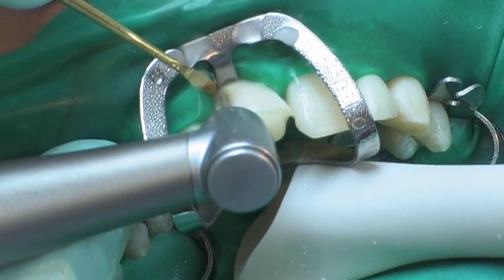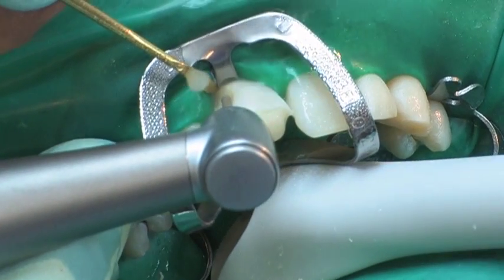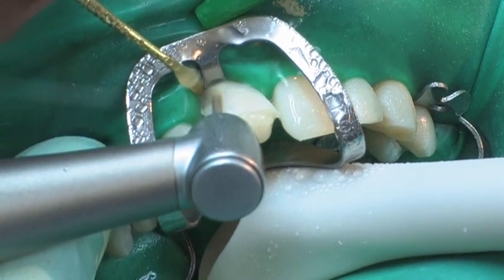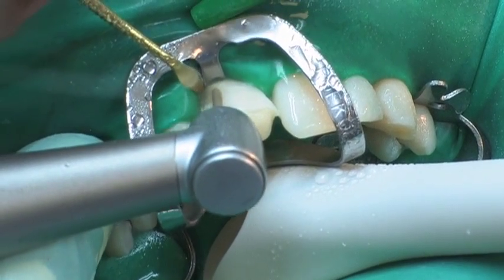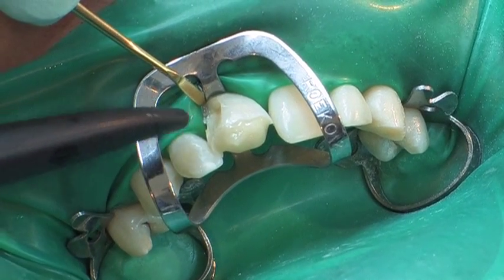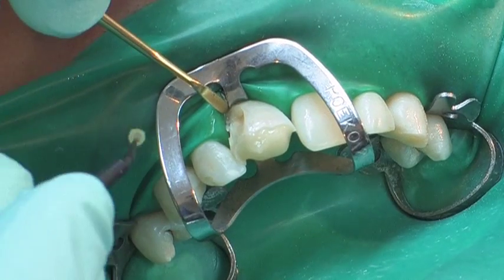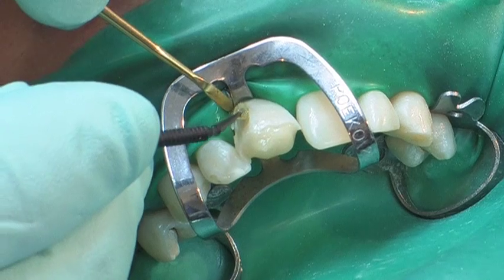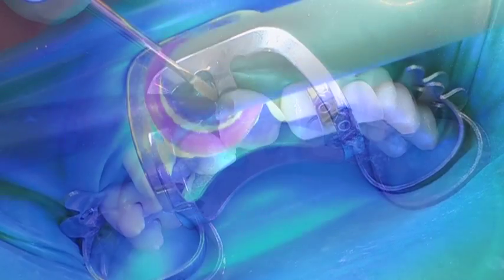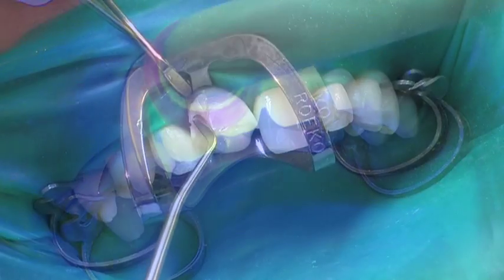The defect on the cervical margin is prepared using rotary instrumentation, while preserving as much tooth structure as possible. A self-conditioning single-bottle bond is ideally suited for placing small composite restorations in this manner.